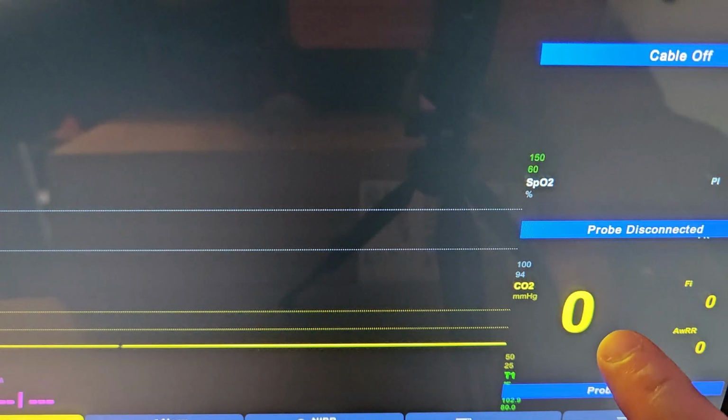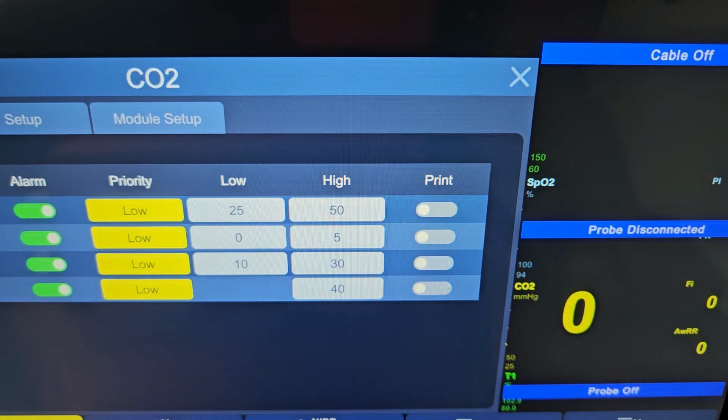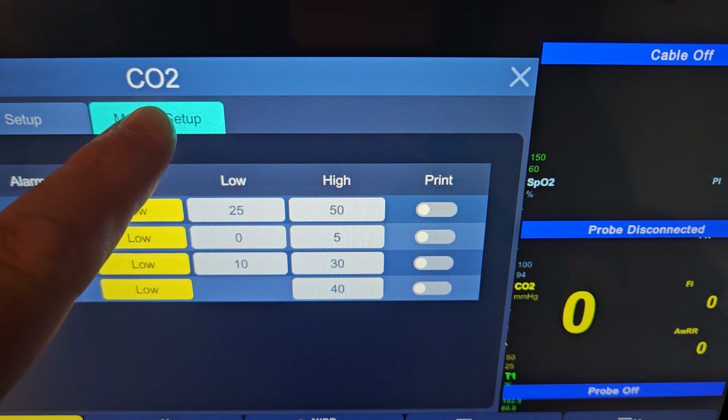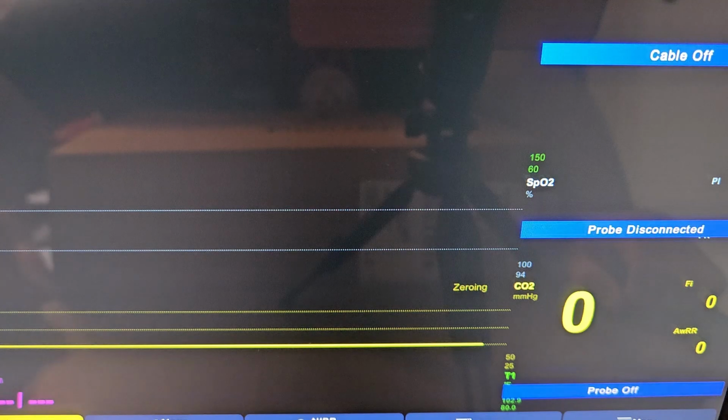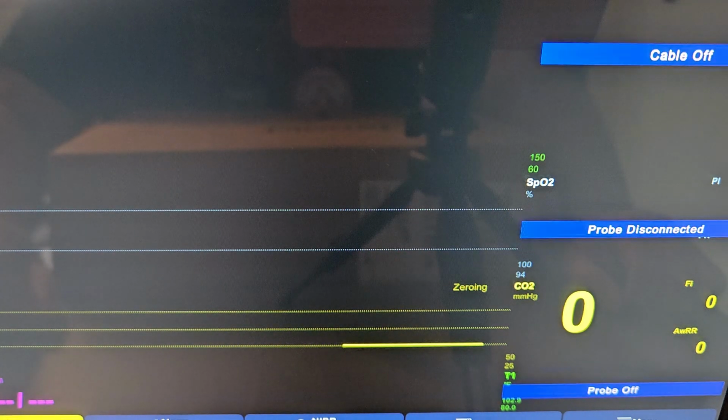Now tap on the EtCO2 numeric box on your monitor, and tap the Module Setup tab on the top of the window. Now tap the 0 button at the bottom of the window. The window will close, and a zeroing message will appear at the top right of the waveform window. Wait for this message to clear, and then proceed with attaching the sensor and adapter to the endotracheal tube.